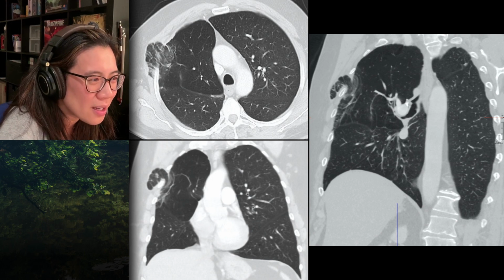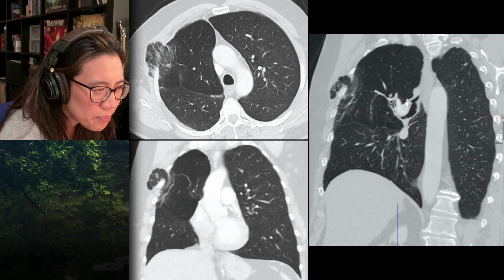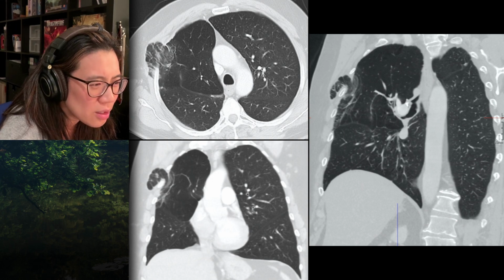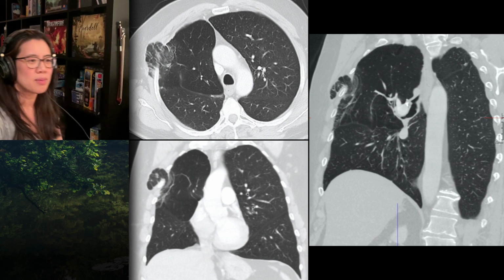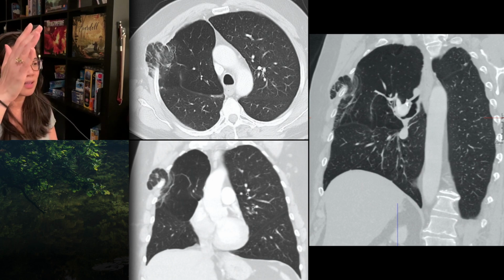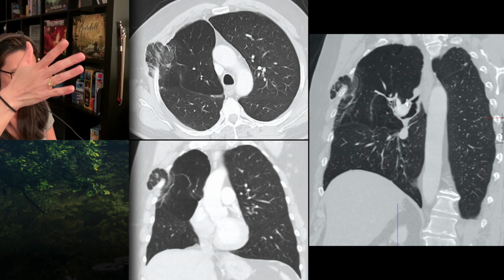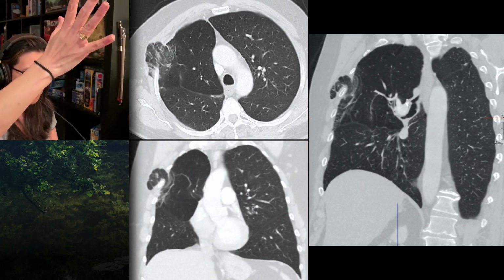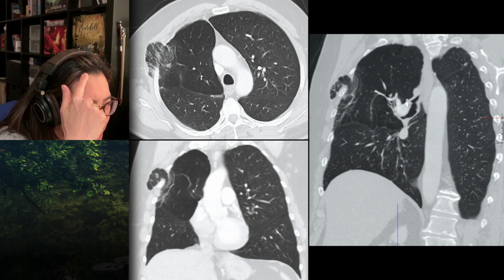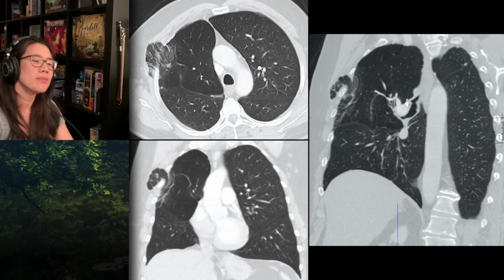So what's happened? There's a funny swirl at the right hilar region. And you tell us about the densities of the lung. That's what we're talking about. So today, the right upper zone lung, whichever lung that is, I'm assuming it's middle lobe flipped up, but I'm a bit uncertain based on the images provided. My guess would be it's the right middle lobe that's popped up. The way you can tell is to follow either the vessels or the bronchi. The vessels in all the rest of the lung belong to the lower lobe, and they don't connect to that one. And he hasn't got an upper lobe, so that must be the middle lobe.